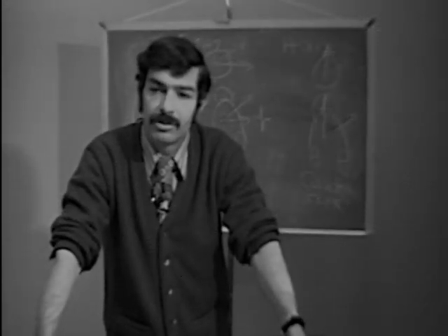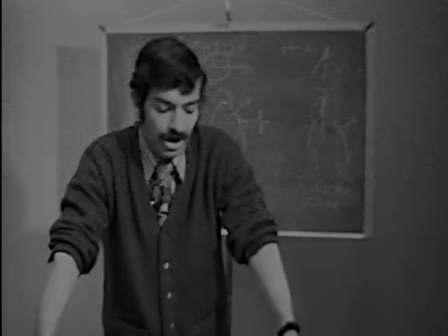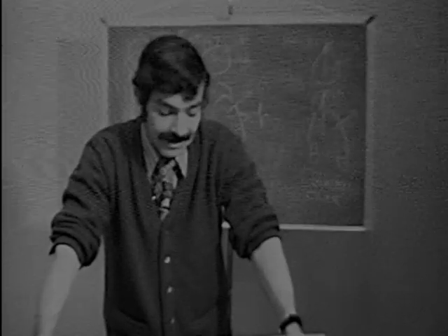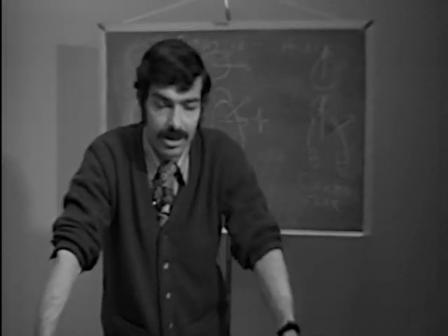Position and rotation, this is something that's nice to know. It's really not that vital or important. Okay? So the important things to summarize then again: heart rate, intervals, axis, derivation, normal R wave progression, and T waves.